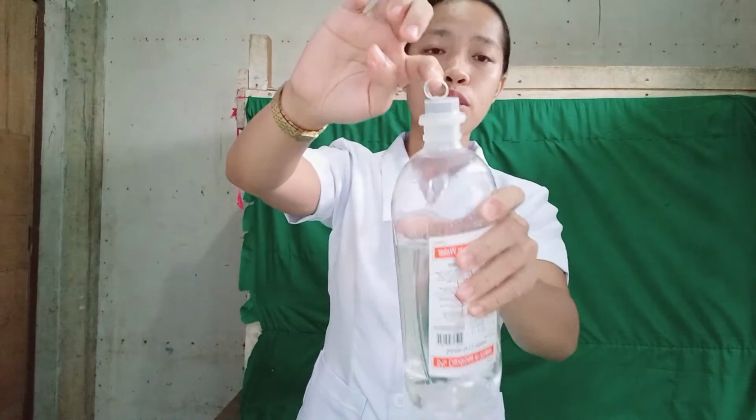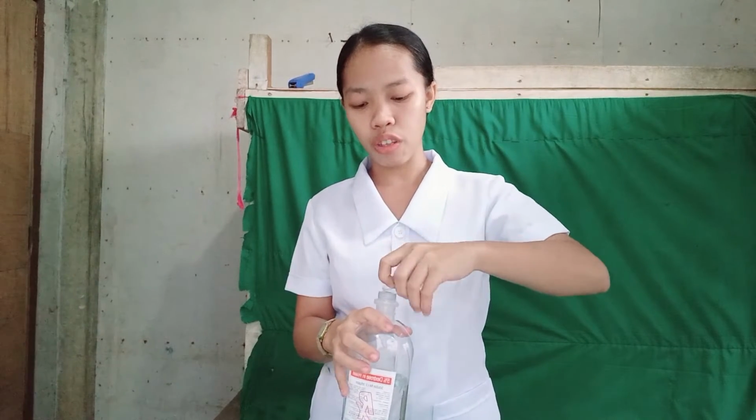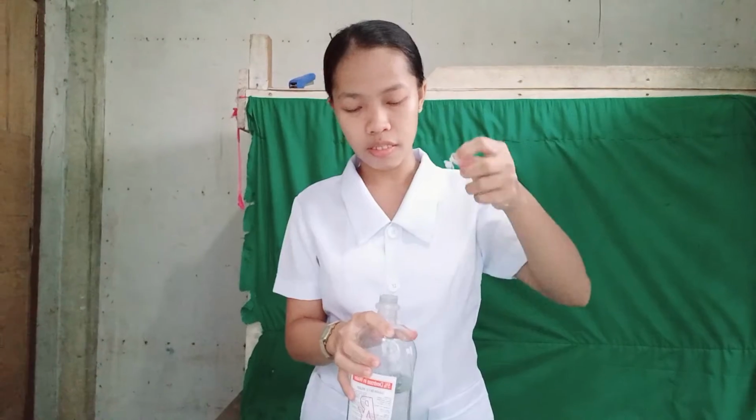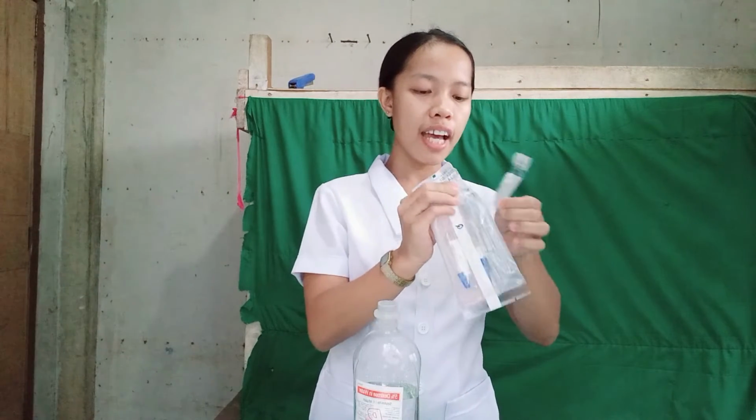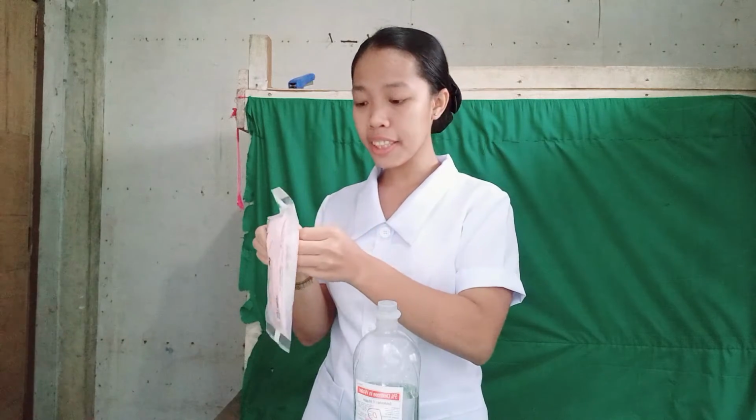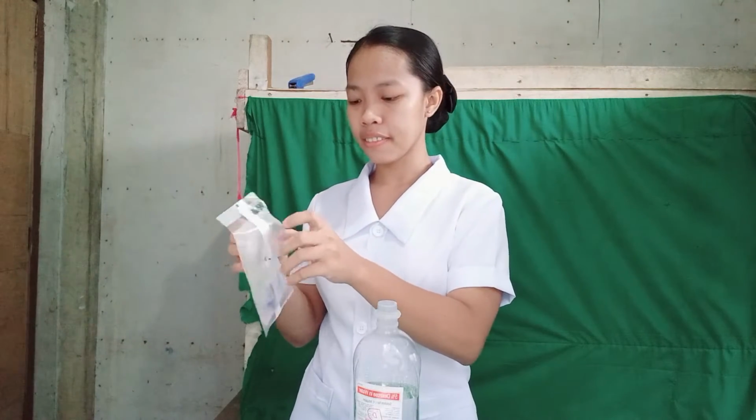And now we will start opening our fluid by pulling the cap of the bag. As you can see, it has a cap, so we will pull this one. While pulling, we should maintain aseptic technique since this package is considered sterile, and also to prevent contamination of the IV solution. We'll discard this one in the kidney basin. Next, we will open the infusion set. In opening, make sure that it will not dangle and we should not touch the tips, to maintain sterility.